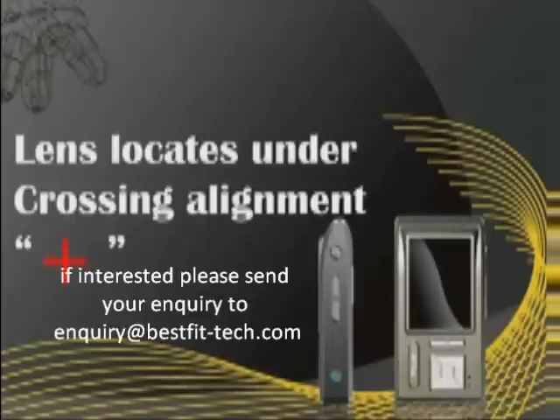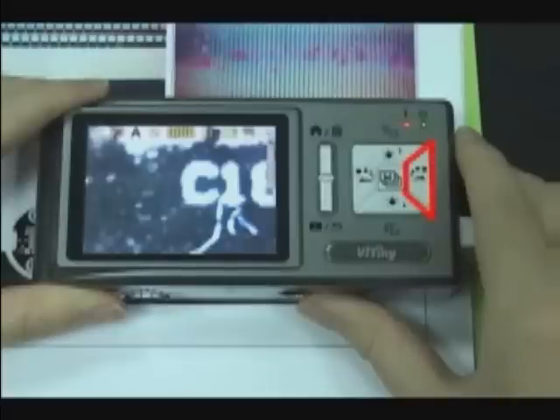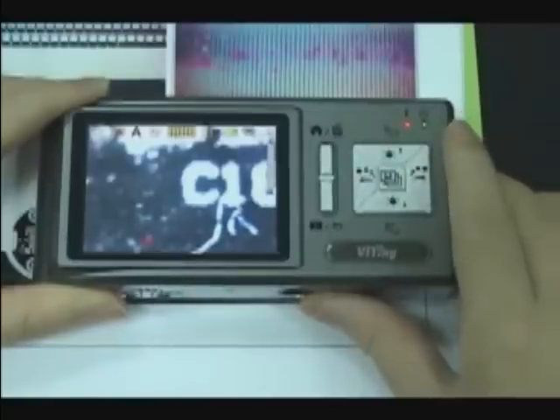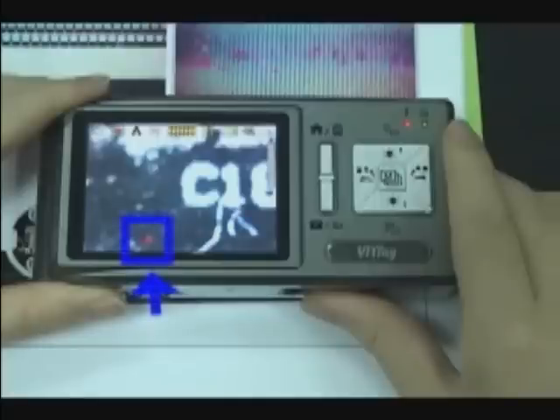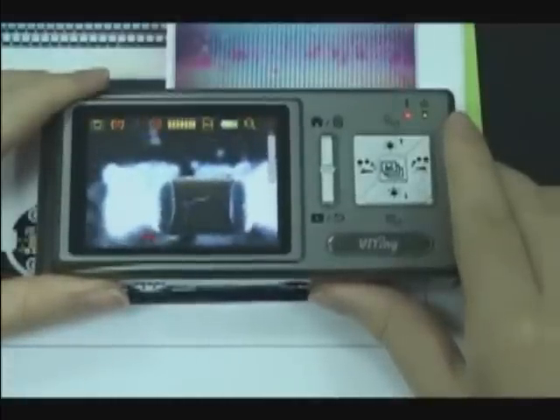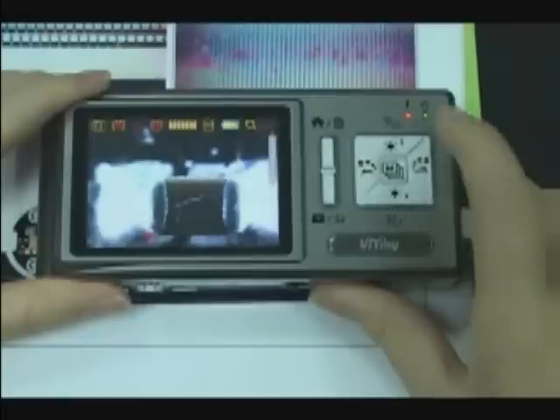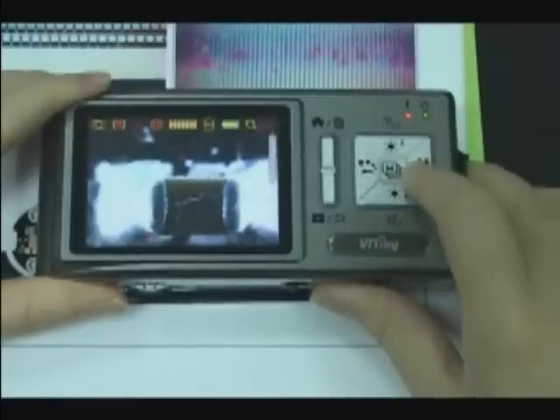Lens locate under crossing alignment. Press the right button for a long time to display the crossing alignment sign. Use it to show the position where the lens of the machine is located and make alignment more convenient during observation. Press it again to shut down the sign.